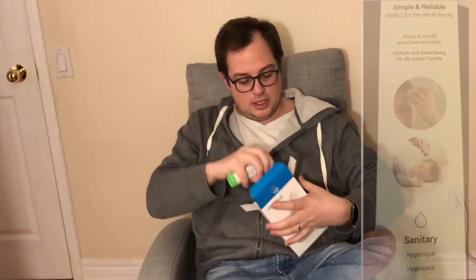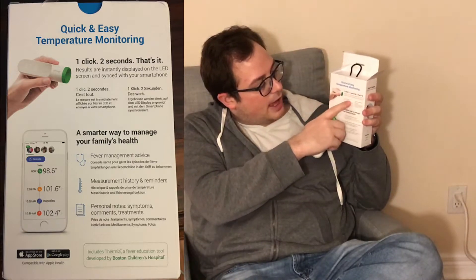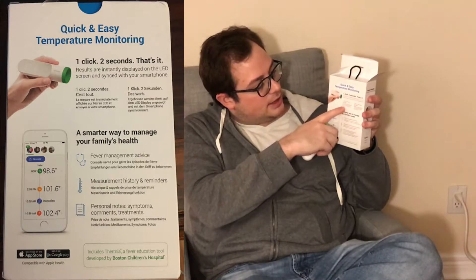That was quite a nice unboxing experience. You can see the instructions here are on the back. What we've got here is this hotspot sensor technology — there are 16 infrared sensors on this part of the thermometer that take over 4,000 measurements in a couple of seconds to identify the hottest point and deliver a precise result in seconds. The instructions basically say: click, 2 seconds, that's it.